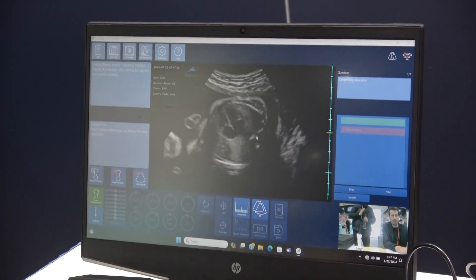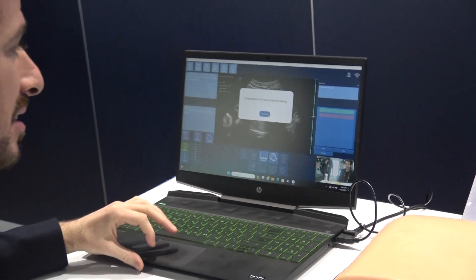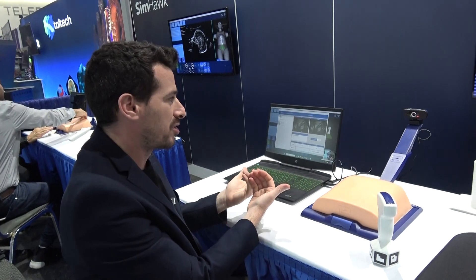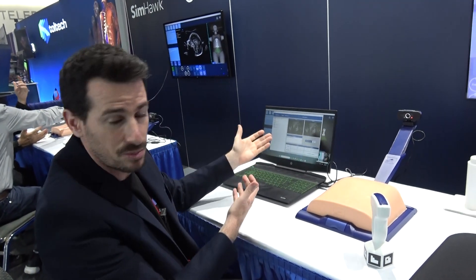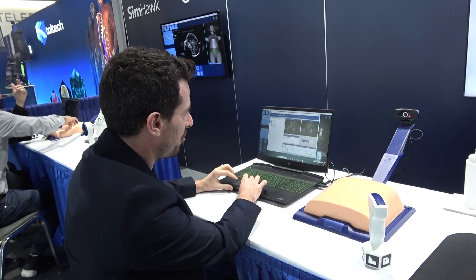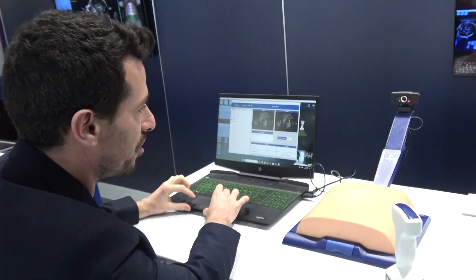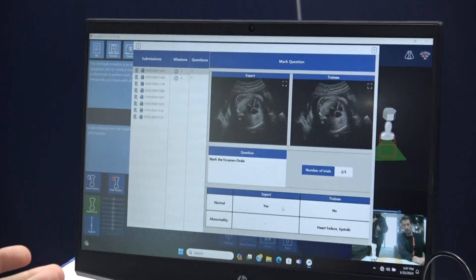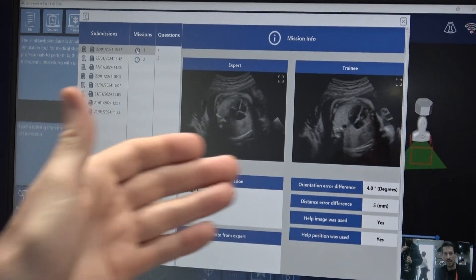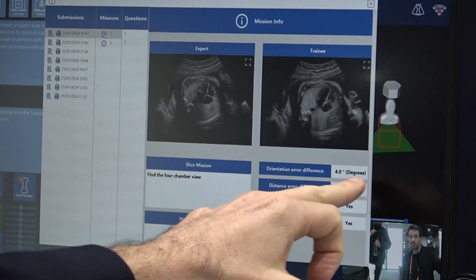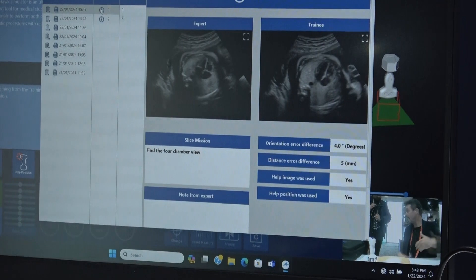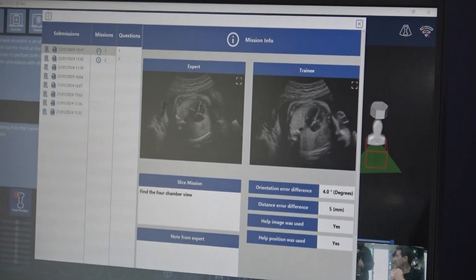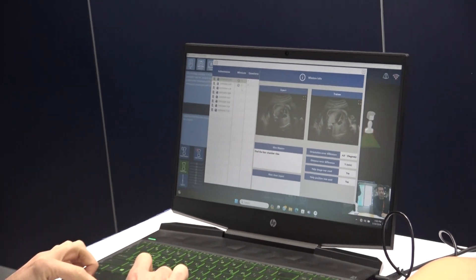Once I finish, there's a performance feedback. The feedback gives a performance comparison of the trainee's results with the expert that designed the training. For the first question, it took me two trials to actually achieve the right solution. The expert said it was normal, I said it was not normal, so I was wrong. If I click on information, I can see how many orientation degrees of error there were, what the distance difference was, and whether I used the help image or help position — so it's good for the instructor to know if the student used help buttons or not.